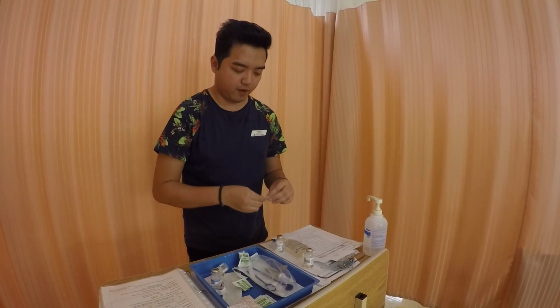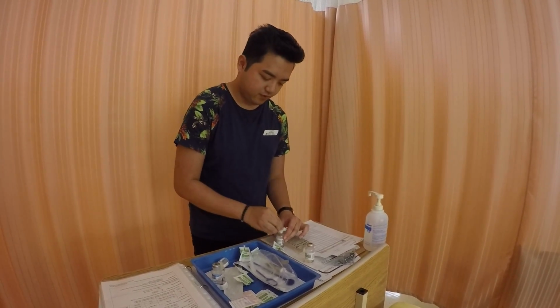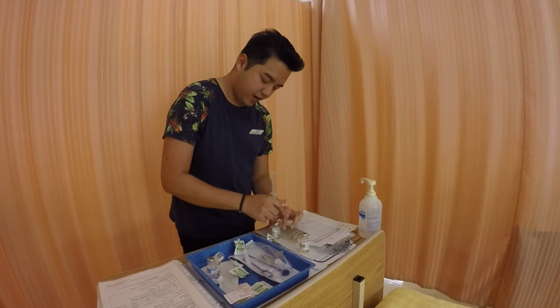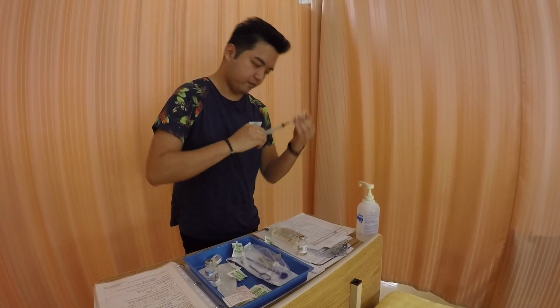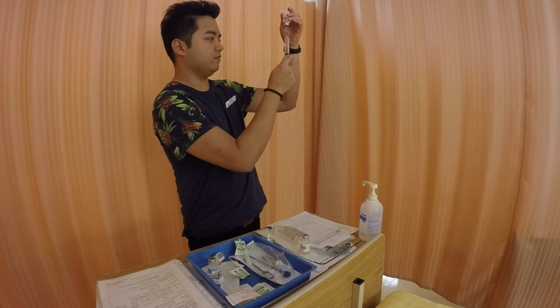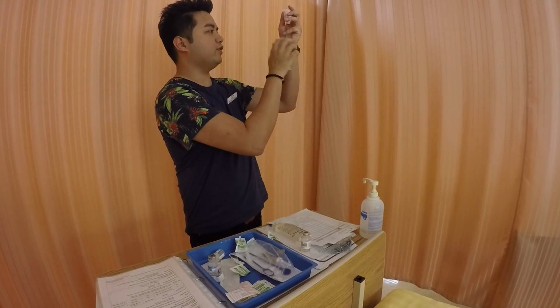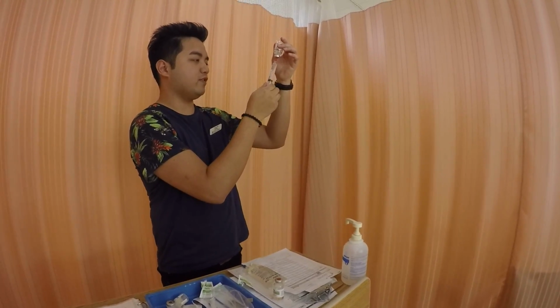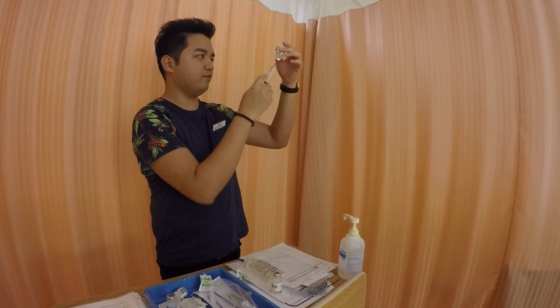So we just need to re-swab that again. So 30 seconds and then 15. Inject the air. Get the 10 ml. Okay, make sure there's no bubbles because we don't want to inject if we don't have the right measurement. Okay, there you go.